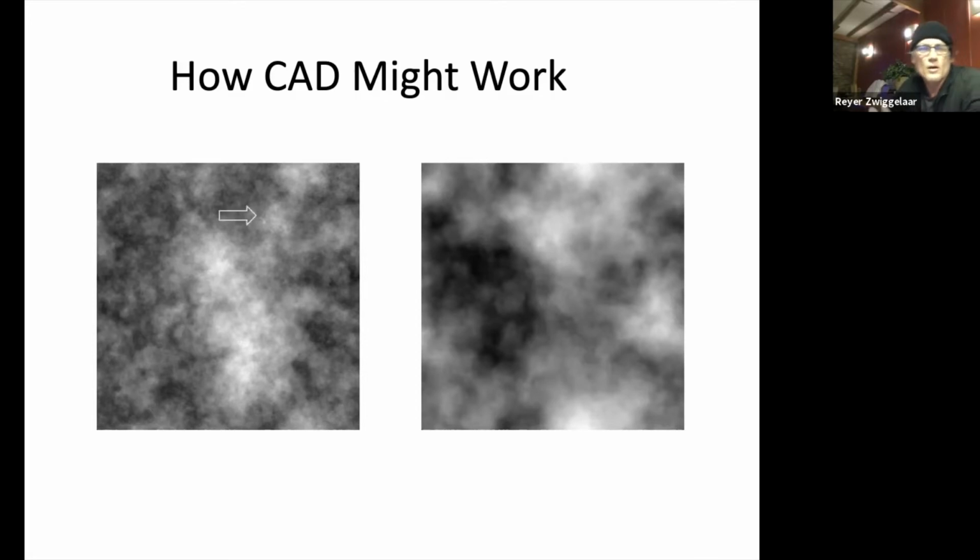So the notion is that there is a true abnormality there, and if I point to that or if I circle that area, then a clinical expert becomes better at finding those. Sometimes the clinical expert will spot them straight away. Sometimes they look at an area and are not sure, and then a prompt from a CAD system might help them. In addition, sometimes radiologists don't spot something, and then clearly a CAD system draws their attention to that area and they might consider it after that. Some CAD systems are very good and will only point to the right things, of course.